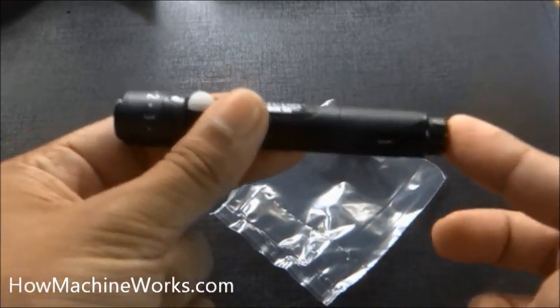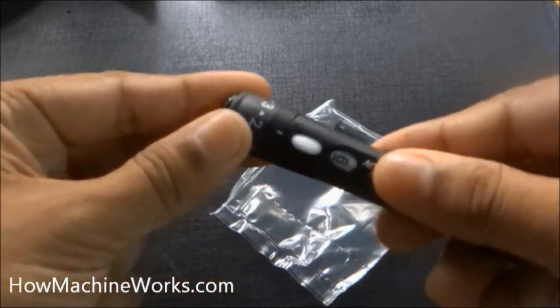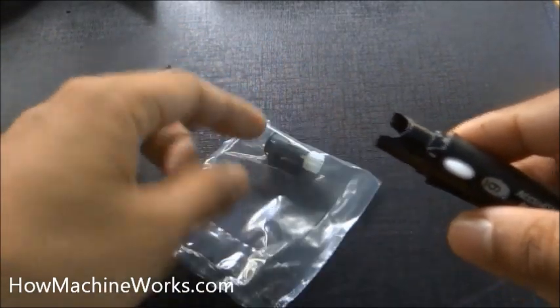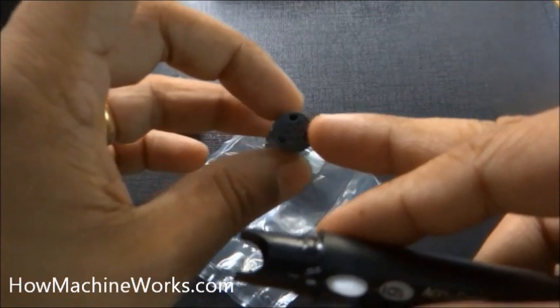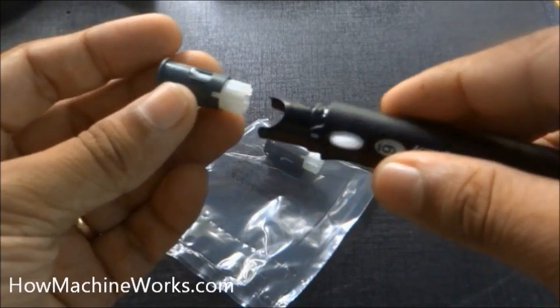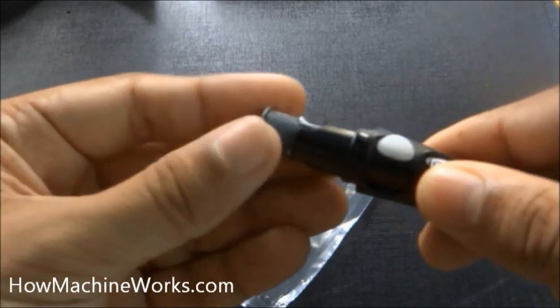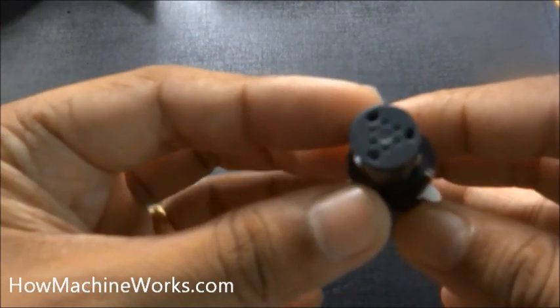At the bottom of the finger pricker we have the release button. By pressing it, the lancet comes out and pricks your finger so that blood comes out. That's the cap which we have removed. Now we need to insert the lancet drum inside, which has six lancets. Just align it and insert it properly through the white section at the bottom. Just twist it and align it — now it's properly inserted.